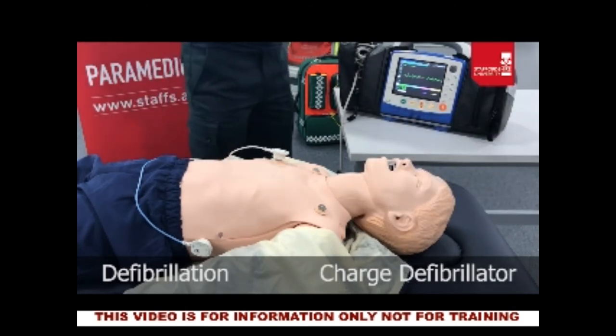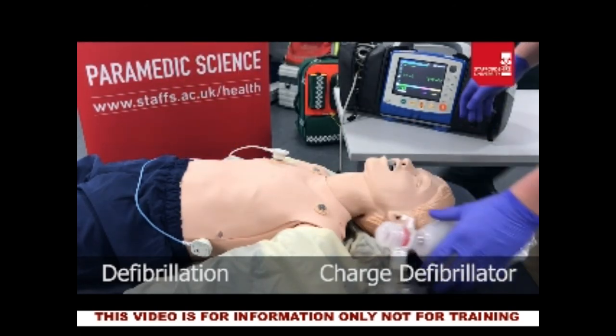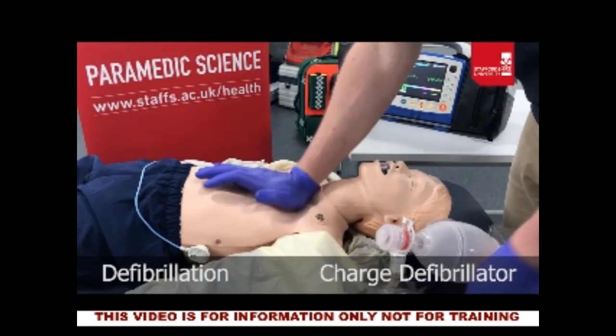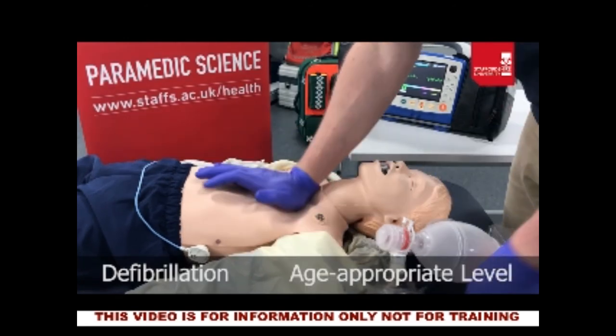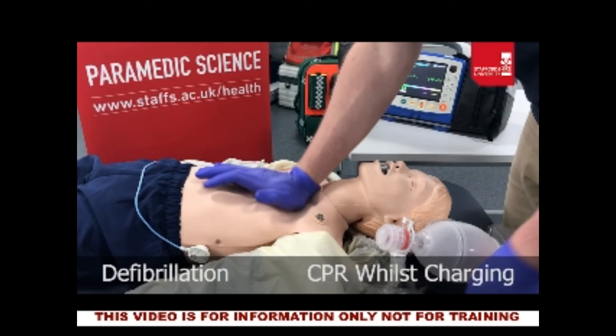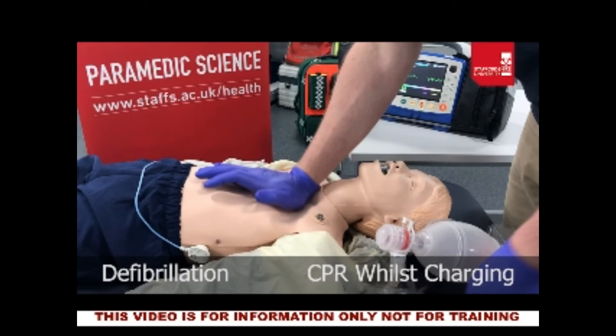Rhythm check: VF confirmed. We charge for defibrillation. Because we have a 7-year-old patient, JR Calc states we need to charge the defibrillator at 100 joules, and we do so with ongoing CPR. Remember it is really important to have no longer than 5 seconds off the chest at any point whether defibrillating or managing the airway.